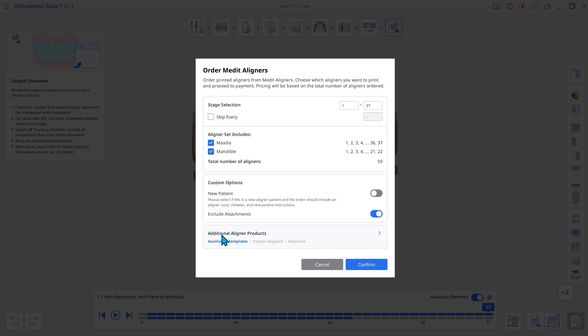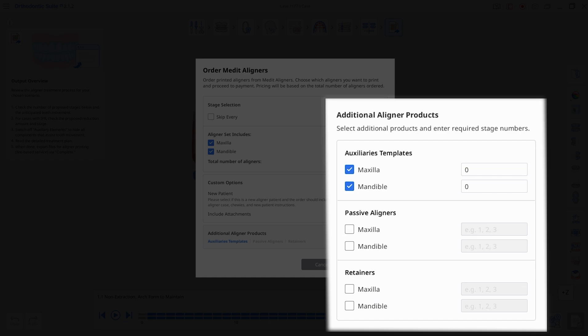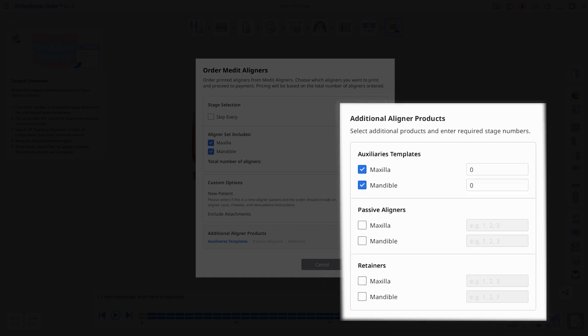When selecting additional aligner products in Auto Medit aligners, you can choose from three types.